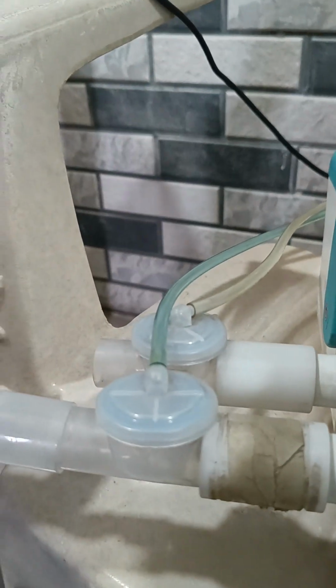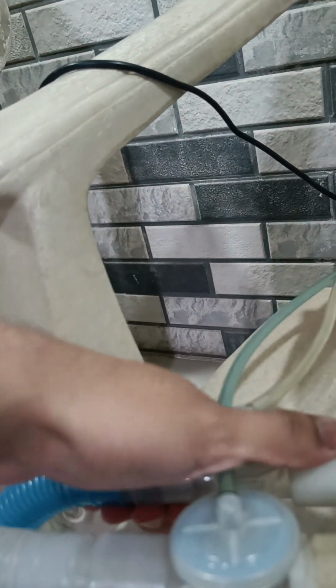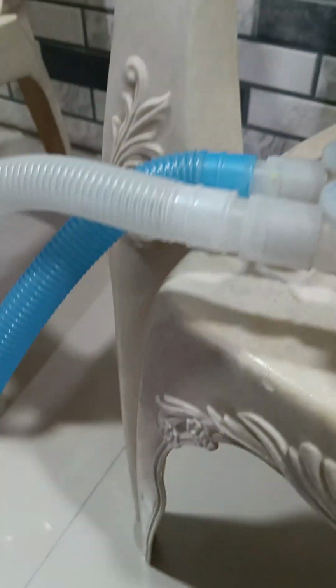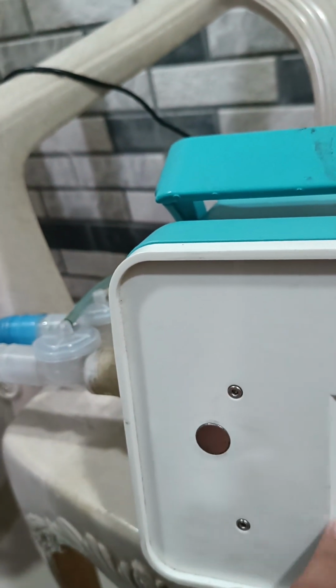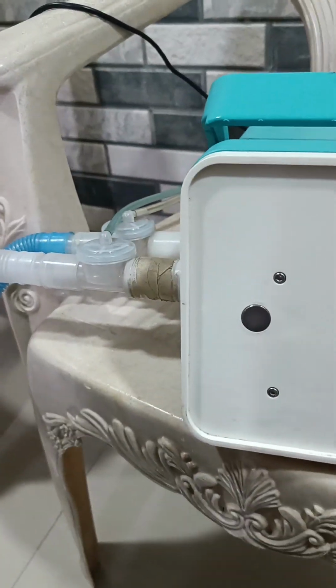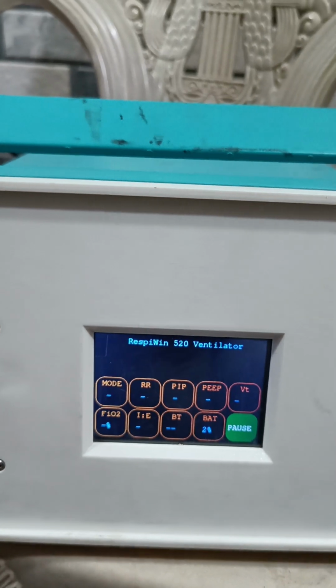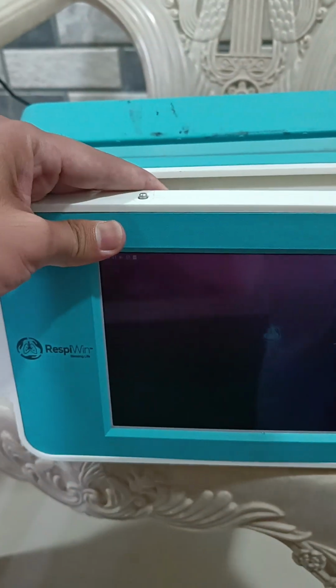Just connect these circuits here, and connect the oxygen supply from behind, and the ventilator will start working. You can connect the tablet again.